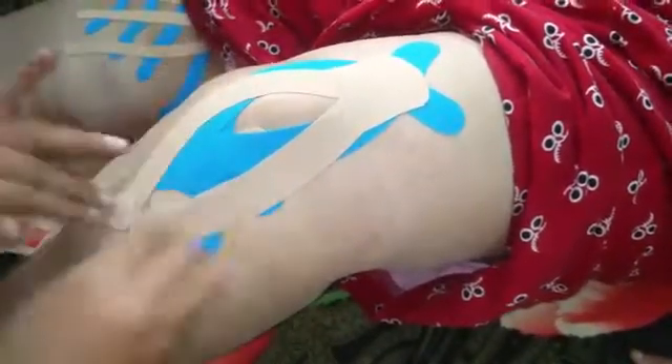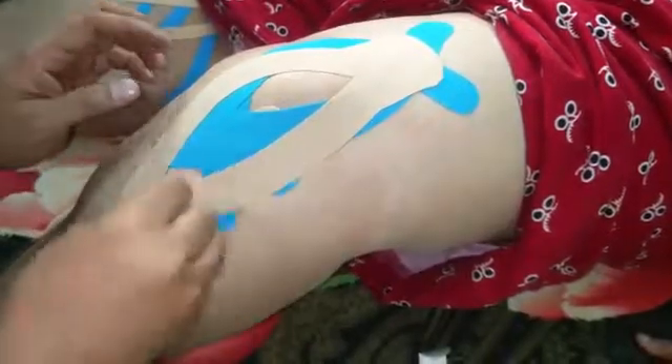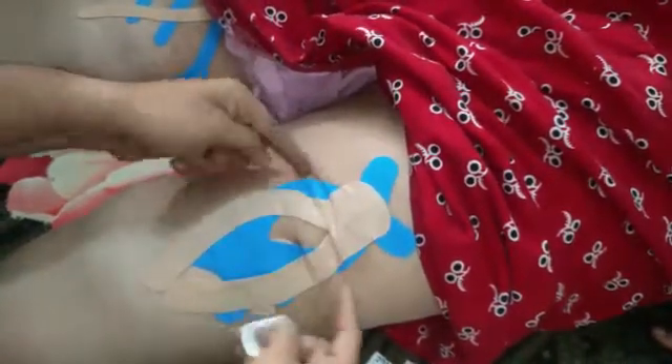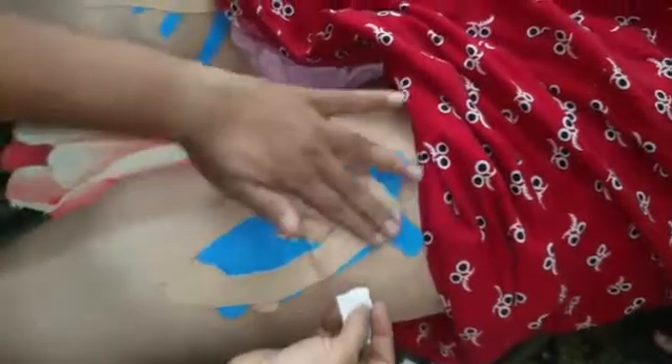Just activate the glue with the back of the tape. In ideal circumstances, you would remove this tape also — that's okay. Can we just extend the leg? And we see that the wrinkles have formed. This is going to lift the myofascia up and help in getting better mechanical advantage to the knee.